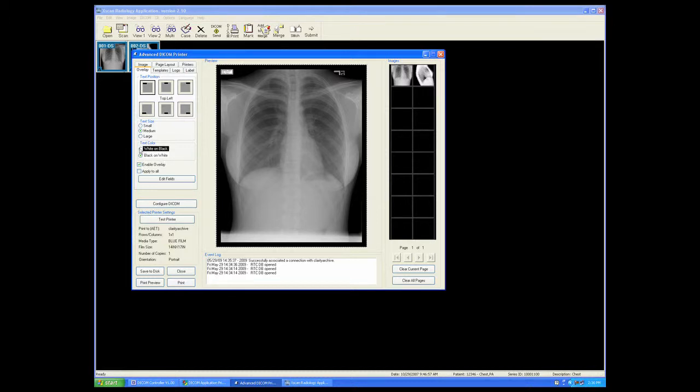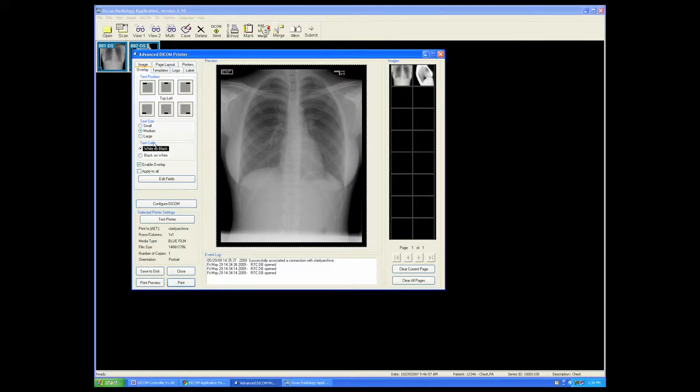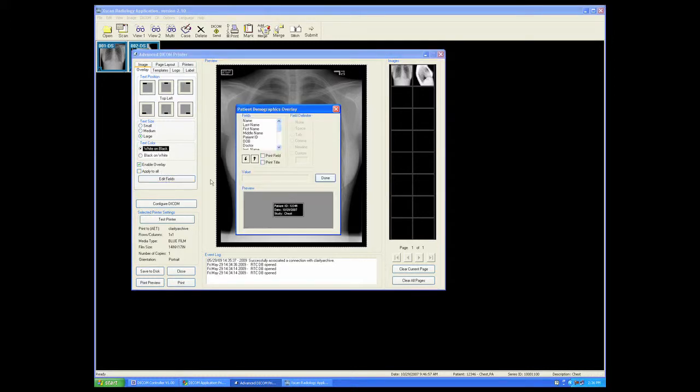We can have a large, medium, or small overlay. And we can edit the fields that are in the overlay by choosing from this menu over here on the left.